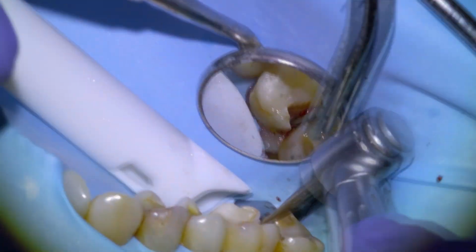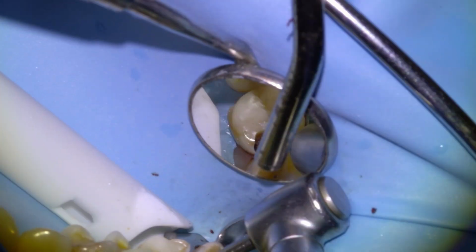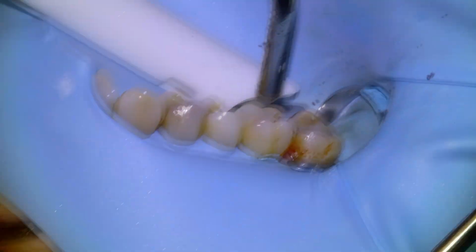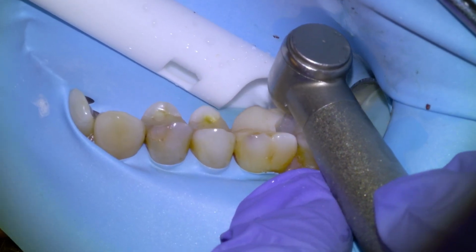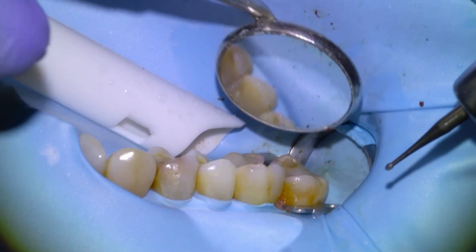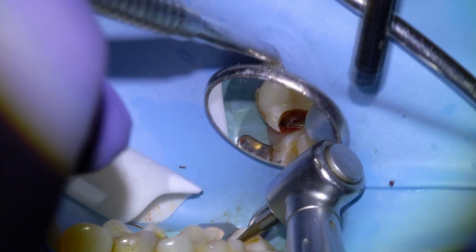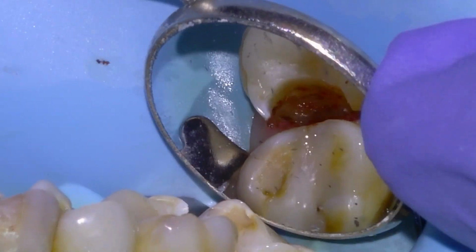Since this was a large lesion, it's going to take a few go-arounds of decay removal, inspection, and then decay removal, inspection until we're back on hard tooth tissue. Still got a ways to go there. Gonna refine with a high speed and keep removing our tooth decay a little bit more on the lingual surface here. Mostly satisfied there.